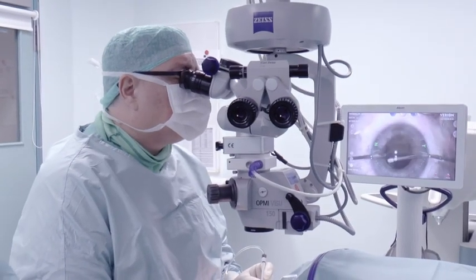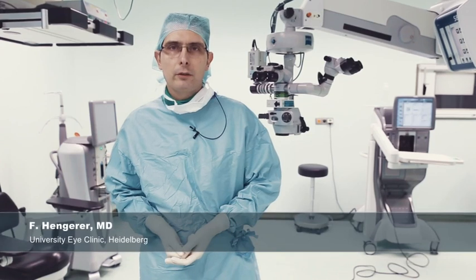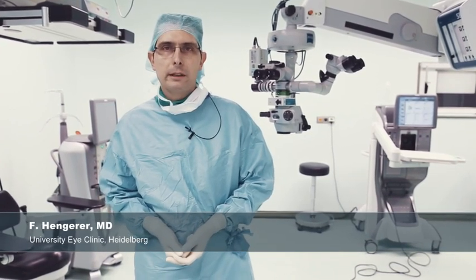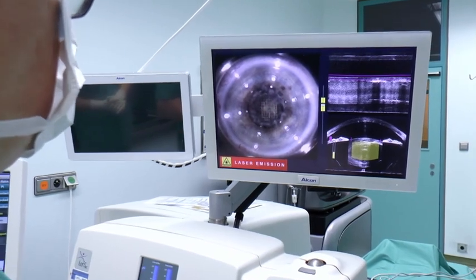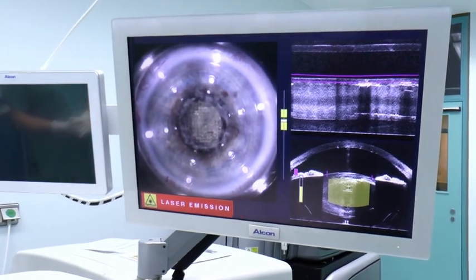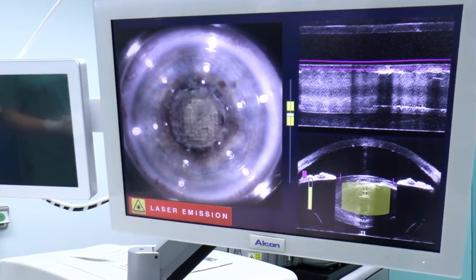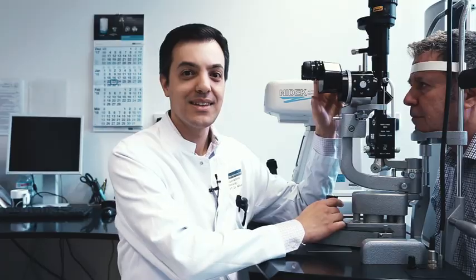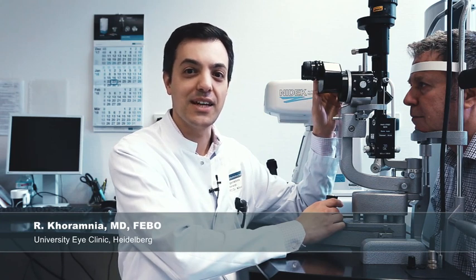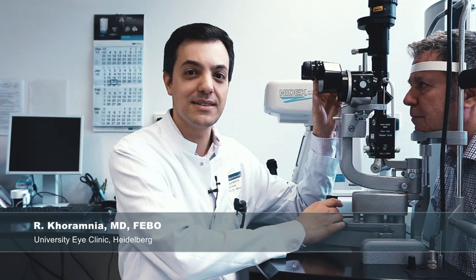patients. In premium intraocular lens surgery, our major aim is to create a perfectly centered and circular capsulorhexis or a capsulotomy by a femtosecond laser to have a stable intraocular lens position over time. The implantation of trifocal IOLs has become the standard of care in presbyopia treatment because of the excellent uncorrected visual acuity results in the far, intermediate and near distance.